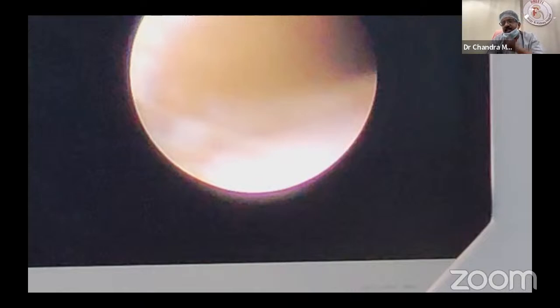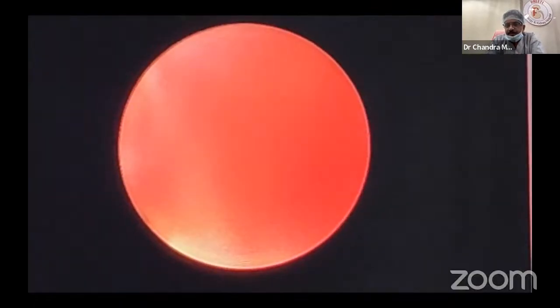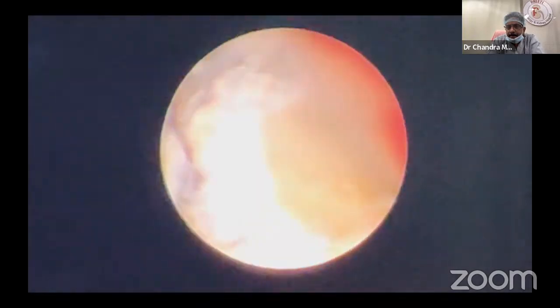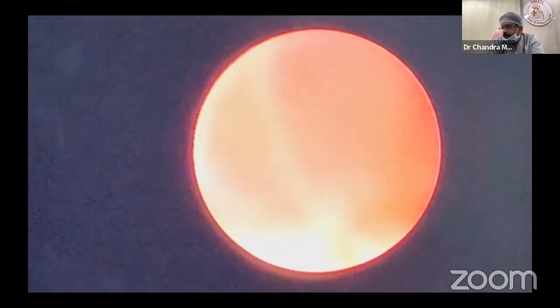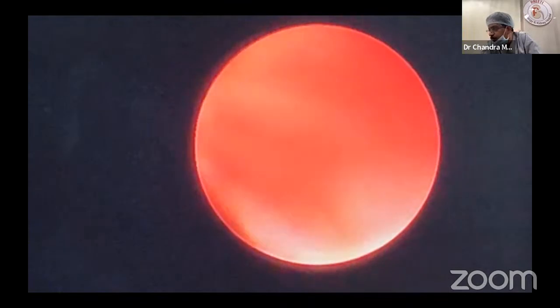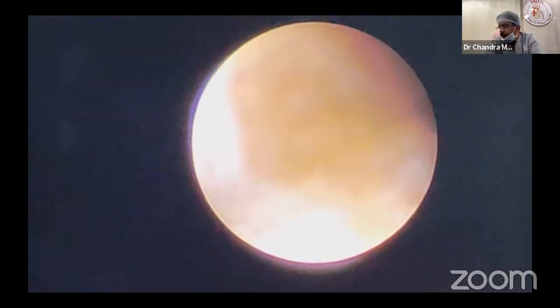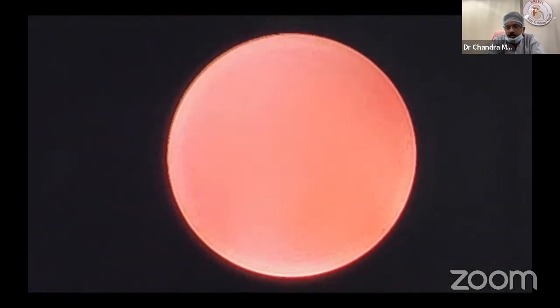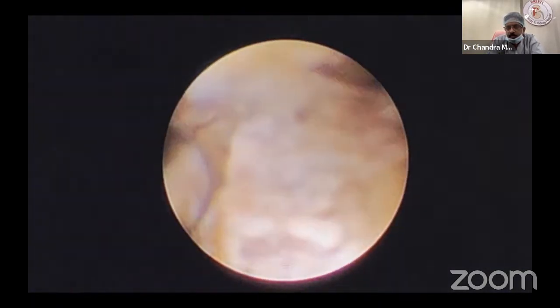You all know this, but this is only for juniors because they will be struggling. They will hold with forceps and remove, bleeding happens, mucosa may get damaged. This video is for juniors only, of course not for seniors who may be more experienced. Pieces will come out of the impacted area. Can you see this? My pneumatic lithotripter is just touching there, and that too not very fast.